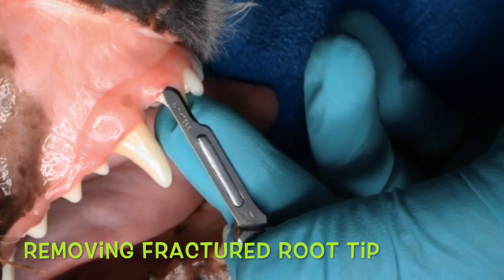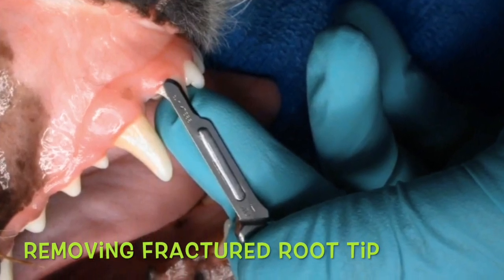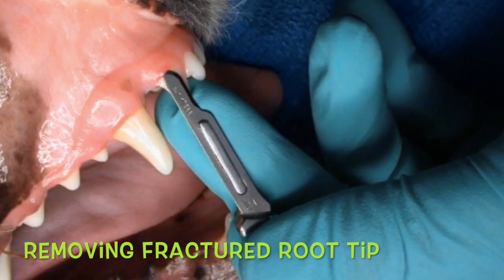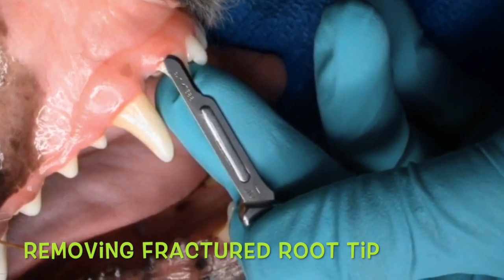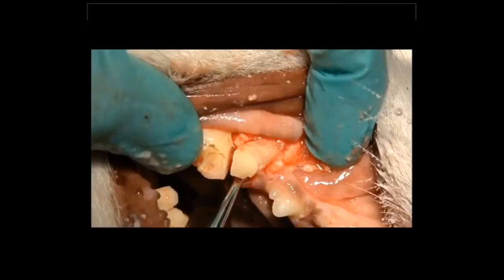How quickly and effectively do we remove fractured root tips? That's a question we all run into. Everybody fractures root tips — I'm not alone in that. I know you guys probably do that as well; I do it every week. So once we have those root tips, we've got to know how to get those out. This is a video that will demonstrate that.